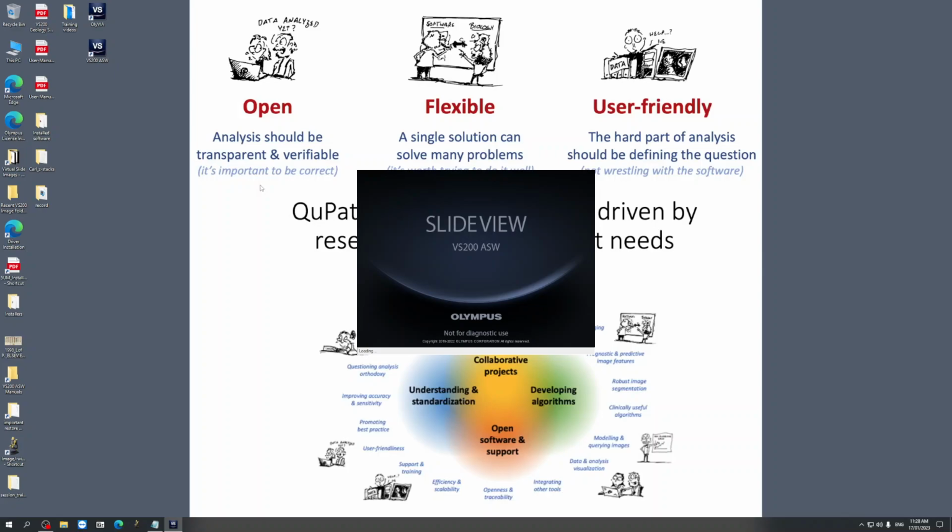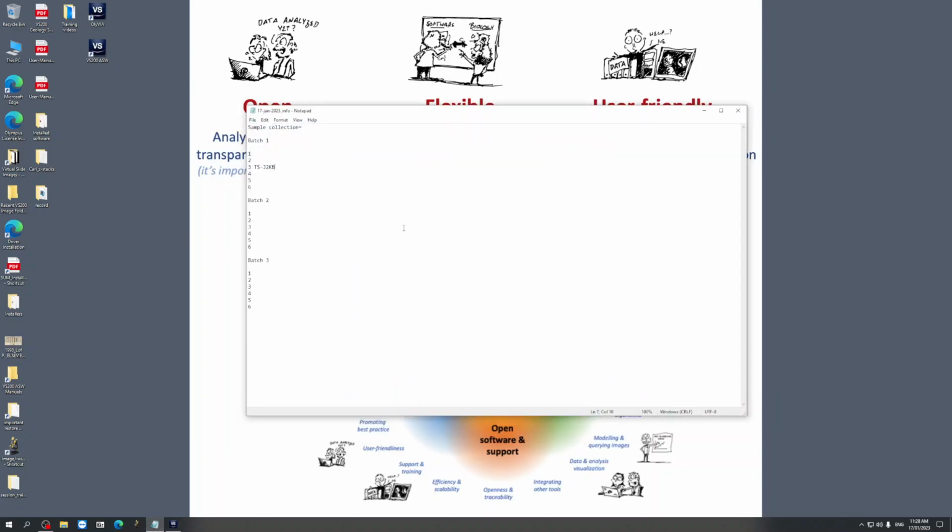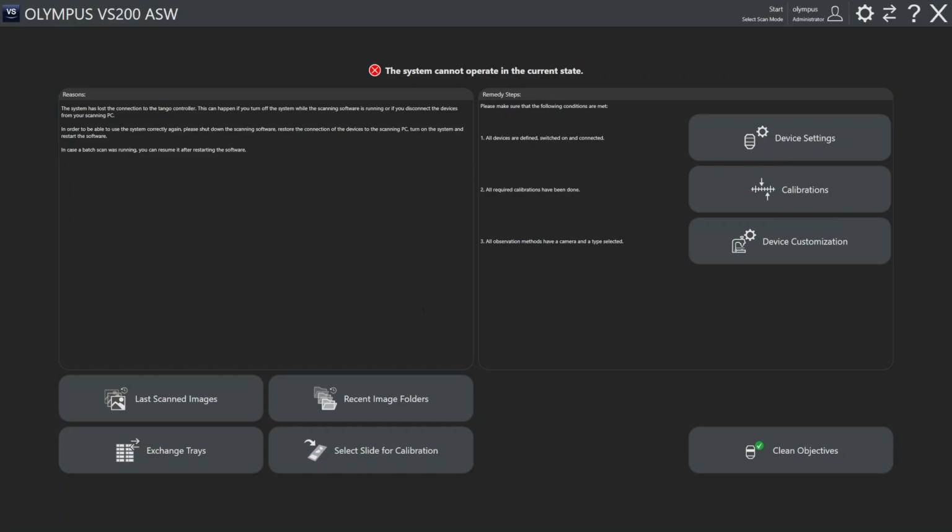The microscope can be used in 6 steps. So the steps for using the microscope are currently 6, and we will describe them during the course of the video.